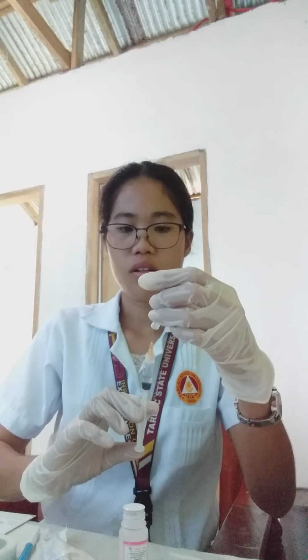Then we get the amount. You have to place the cover and move the needle upward. Then we have to change it, and we have to put the right needle. Then our medication is ready.